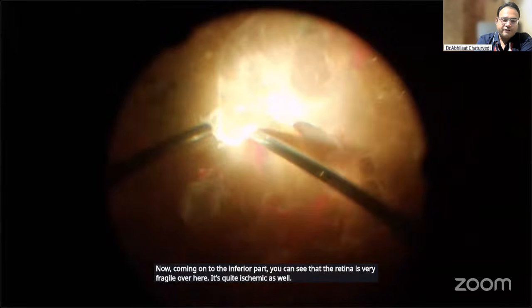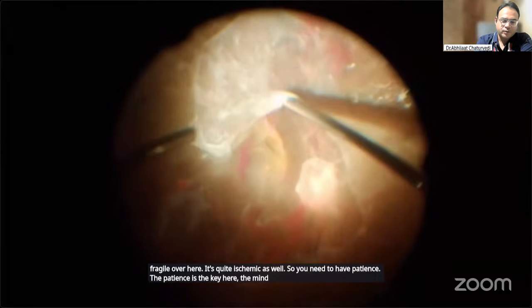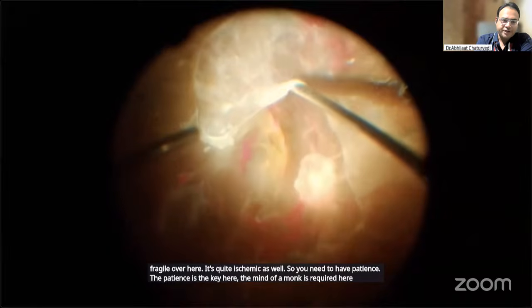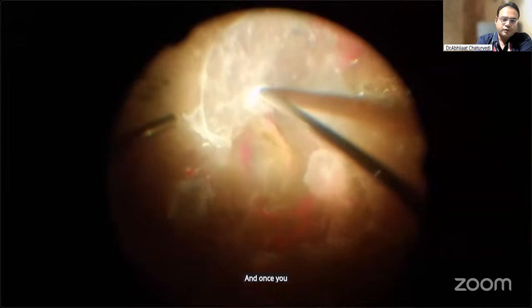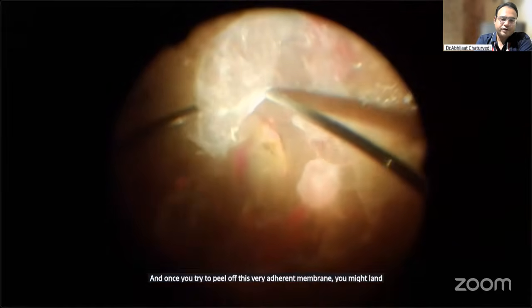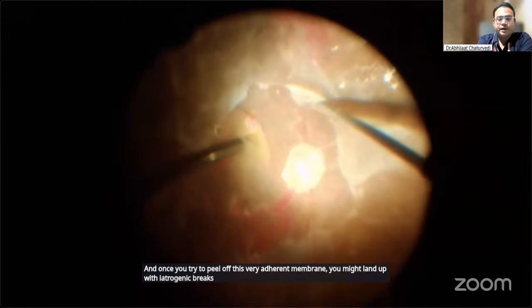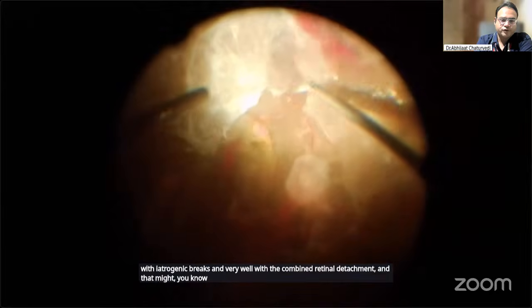So you need to have patience. The patience is the key. The mind of a monk is required here, because there's a temptation to peel off this membrane. And once you try to peel off this very adherent membrane, you might land up with iatrogenic breaks, and very well with a combined retinal detachment. And then you might have to close your case there.